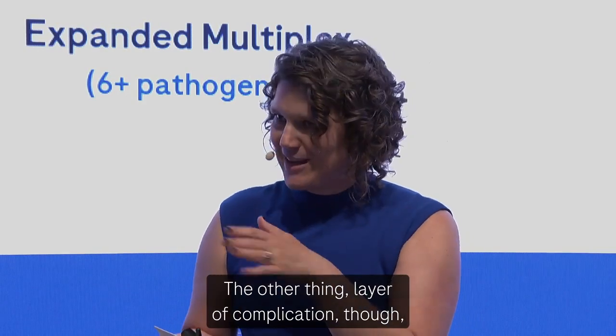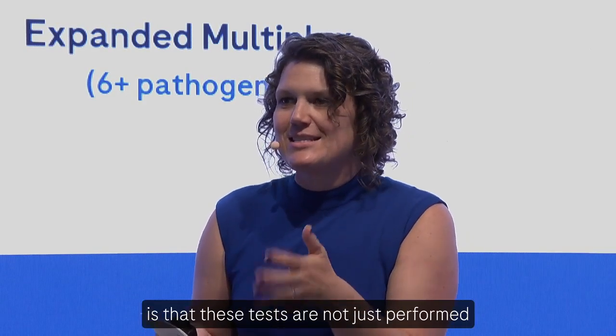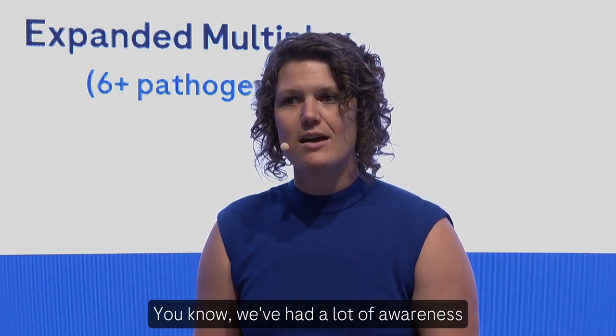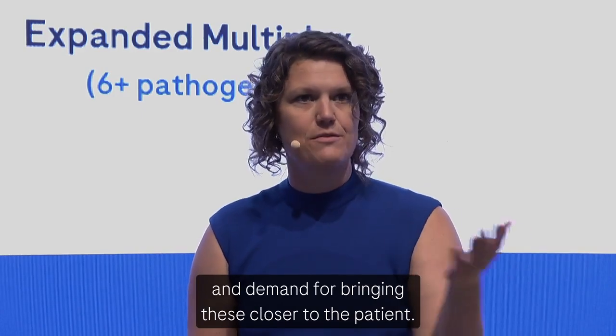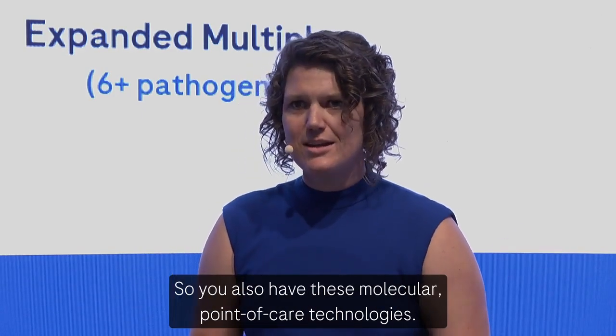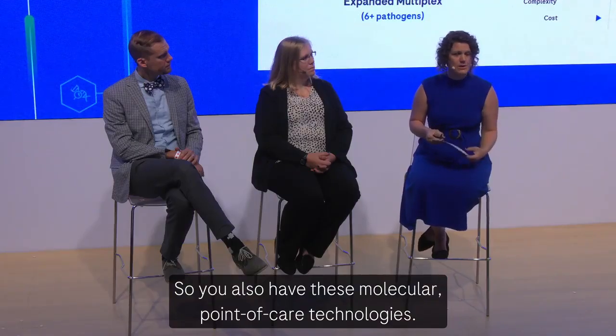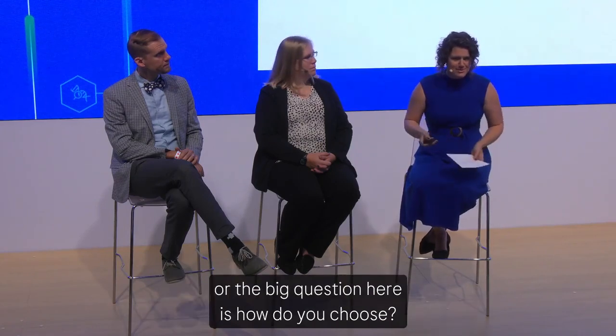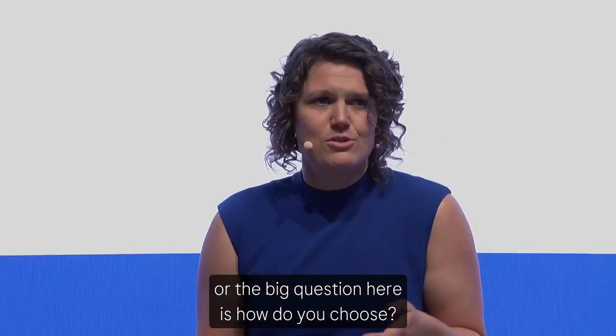The other layer of complication, though, is that these tests are not just performed in the central lab anymore. We've had a lot of awareness and demand for bringing these closer to the patient, so you also have these molecular point of care technologies. And I think the big problem statement is, how do you choose?